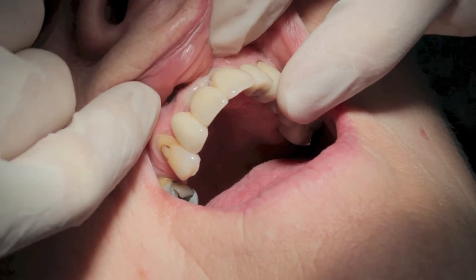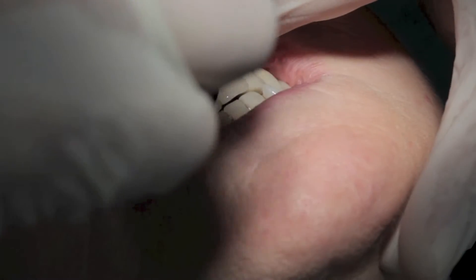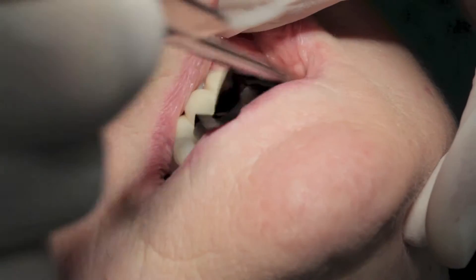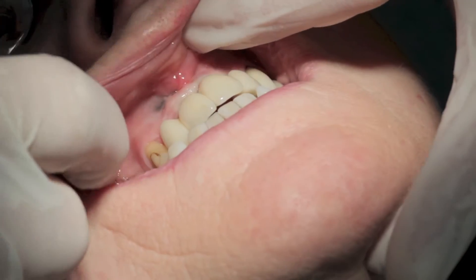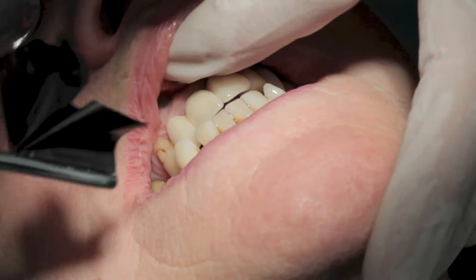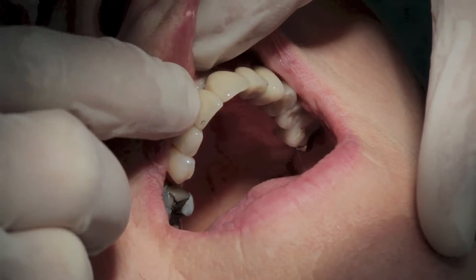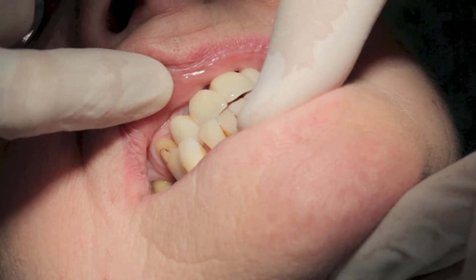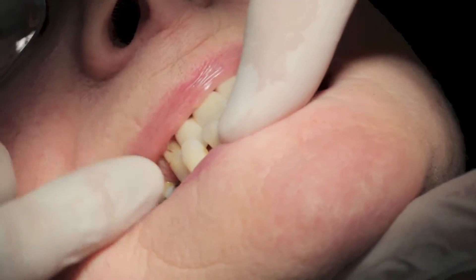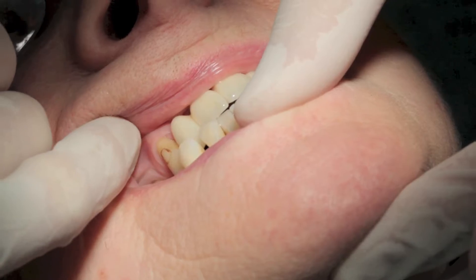Contacts with the adjacent teeth are excellent. Let's check the occlusal contacts now — if we have the articulating paper. Close together and open. We're a little bit proud on this front tooth here. As you can see we've got a bit of a crossbite here which has made things a little bit tricky. But I think if we adjust where we've got a premature contact here, we can re-establish our tooth contacts which we had prior to the bridge going in on these teeth.